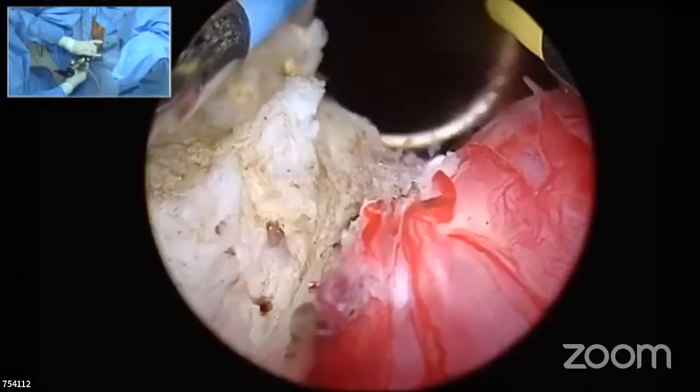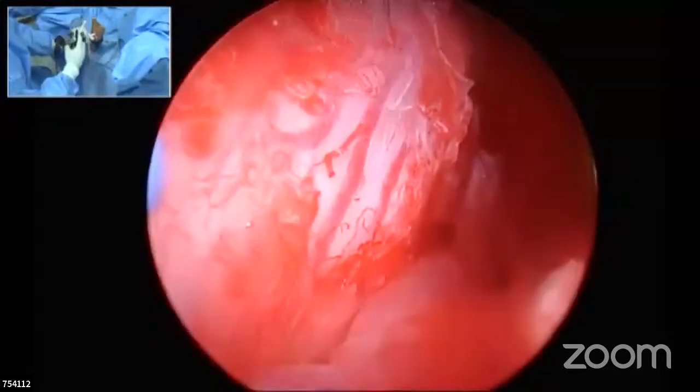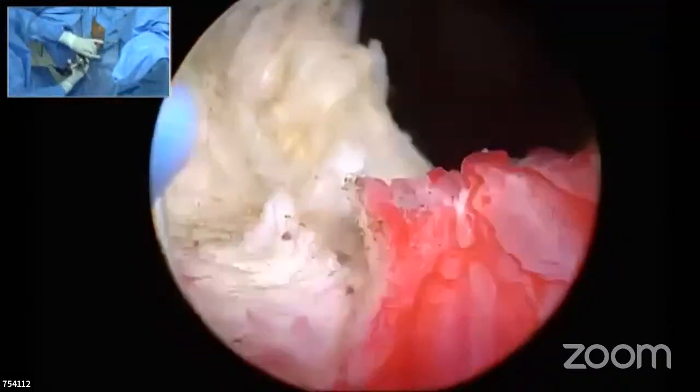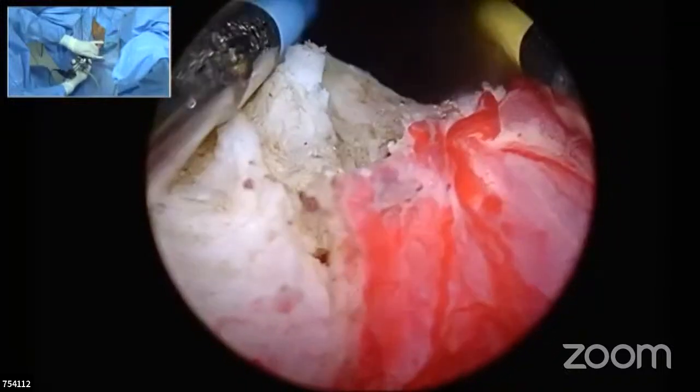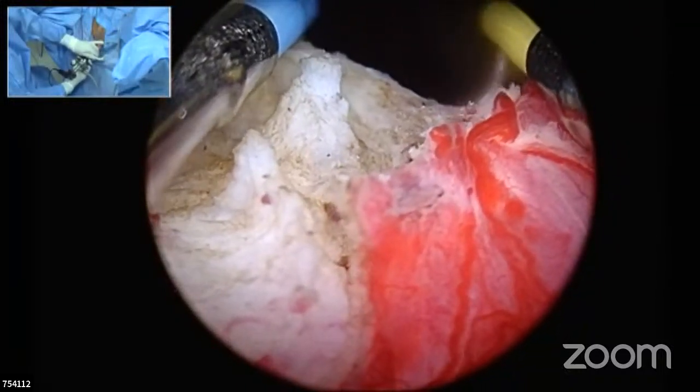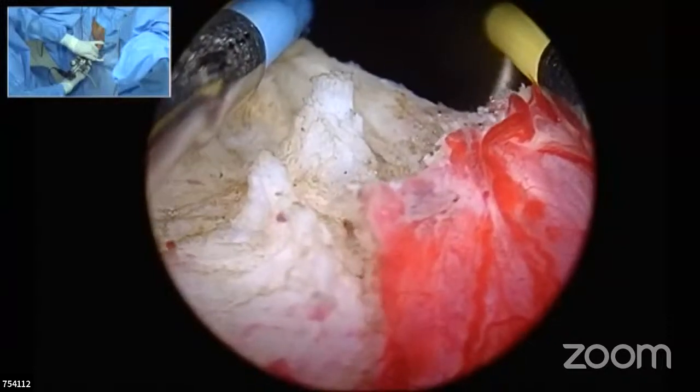No, it is not like that actually. If the gland is less than 30 gram, it is better to leave tissue at the 12 o'clock position. That is a standard teaching. Now I have a 30 gram prostate. I give a bilateral incision and resect the central area.